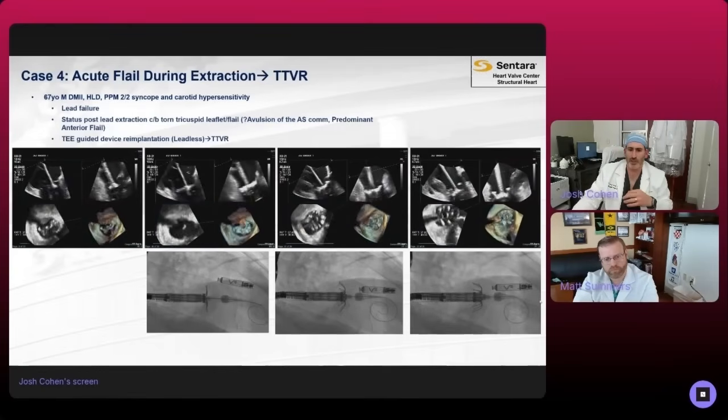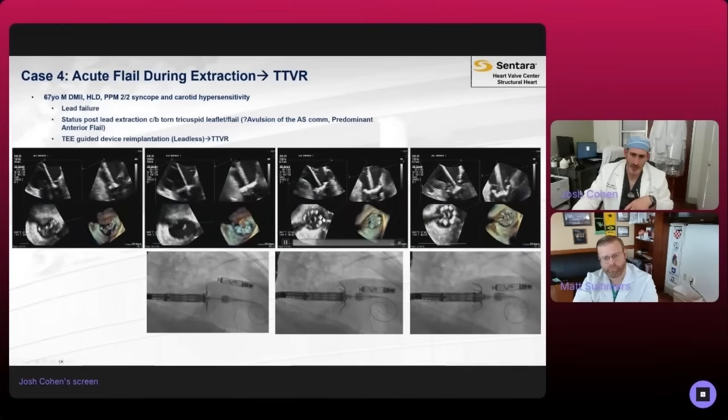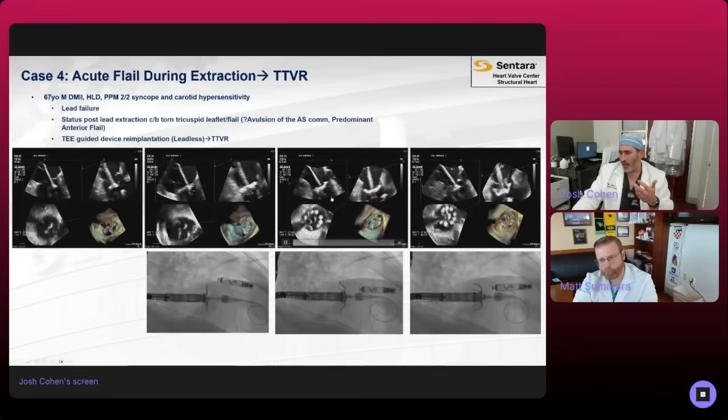And what you do is, kind of in this area here, where you see all these arms, what you want to make sure is that you'll kind of call out in the room, hey, we're looking at green box, left side of the screen, or something like that. It doesn't really matter which side, right? You just have to all be on the same page. And you want to make sure that when you put this green line over each one of these dots here, which are essentially these arms, you want to make sure that the leaflet is up and over and captured.